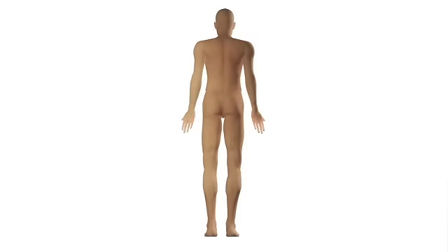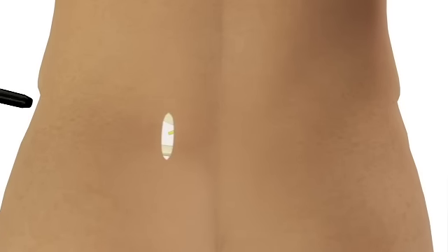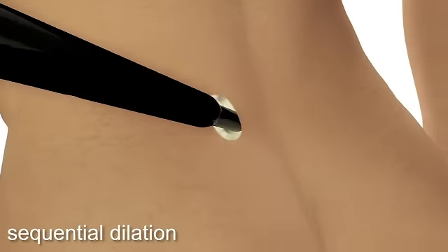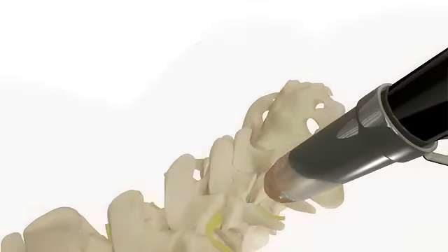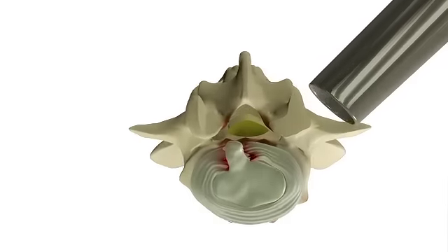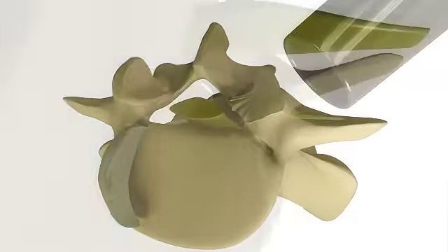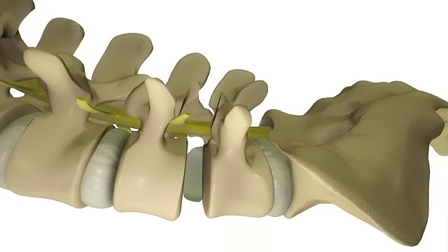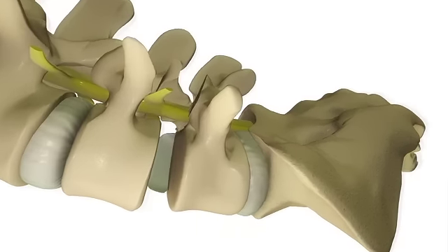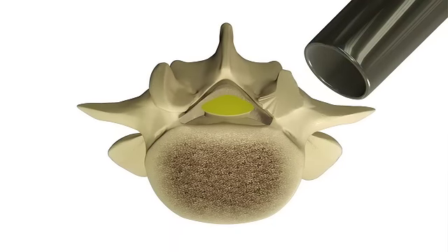During the procedure, you will lie face down on the operating table. Your surgeon will access your spine through a small incision in your back to minimize the disruption of muscle tissue. Your surgeon will place a special instrument called a retractor into the incision and, upon reaching your spine, will remove the disc between the bones to create a space for fusion to occur. If the disc has collapsed from disease, the bones are moved back into a more normal position.